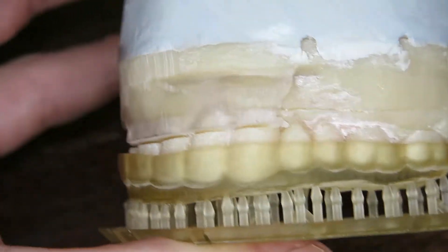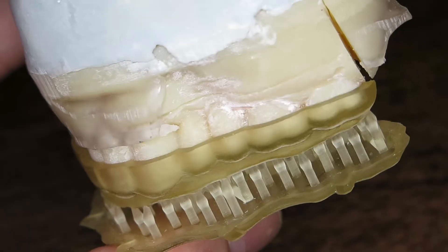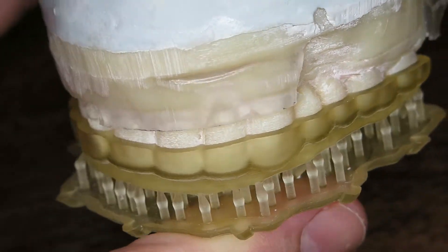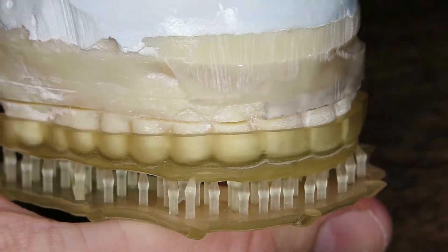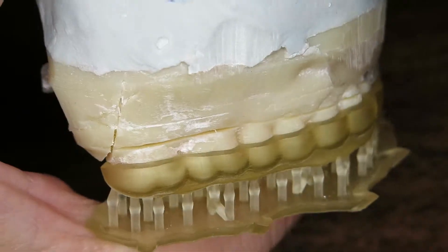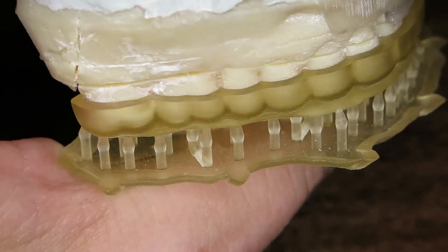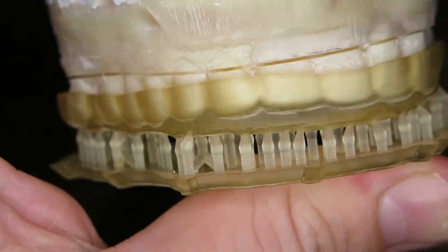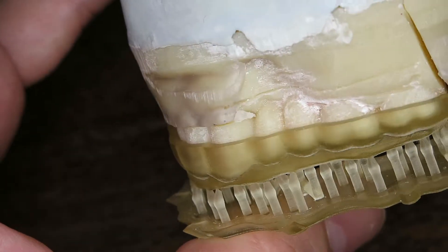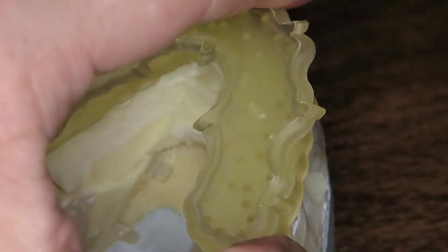This is the first 3D-printed guard made entirely in Blender that I've had a chance to test on the model. This model is a 3D-printed model from a commercial orthodontic lab that makes most of my occlusal guards currently — they do a great job. I'm looking forward to testing this in the mouth versus the guard that they made.